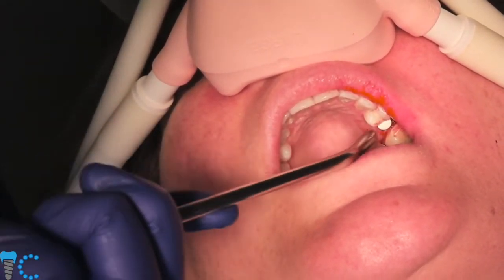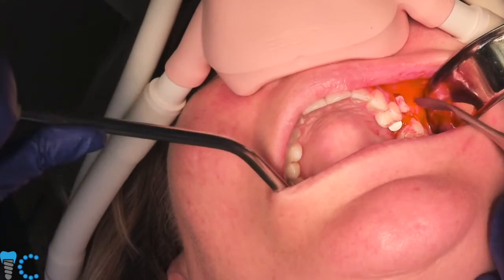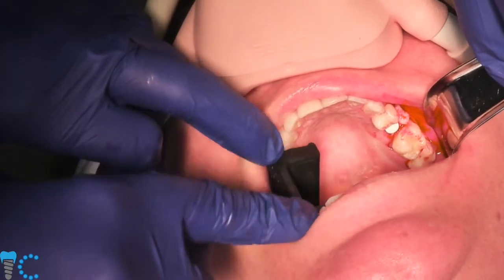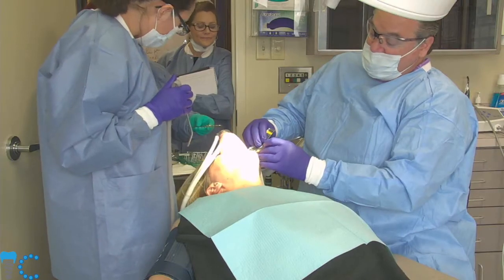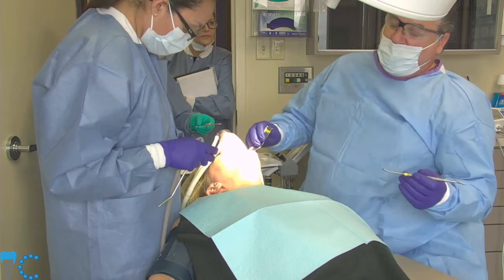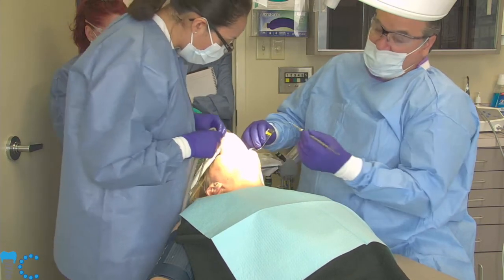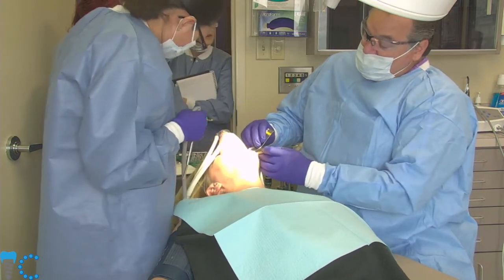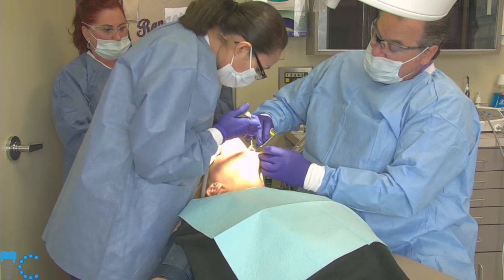These implants have a blasted surface that increases the surface area over a machine surface quite a bit. And then in addition to that, the outer portion of the threads of the implant are laser modified. The laser is used to prep the threads of the implant, and between the blasting and the laser modification, that increases the surface area about 150-fold from a machine surface. So how would you compare osseointegration from ceramic to?